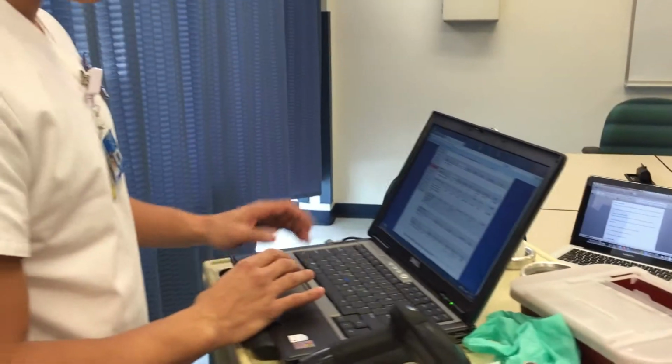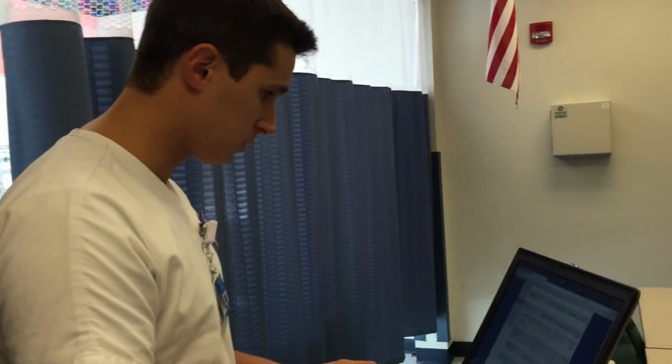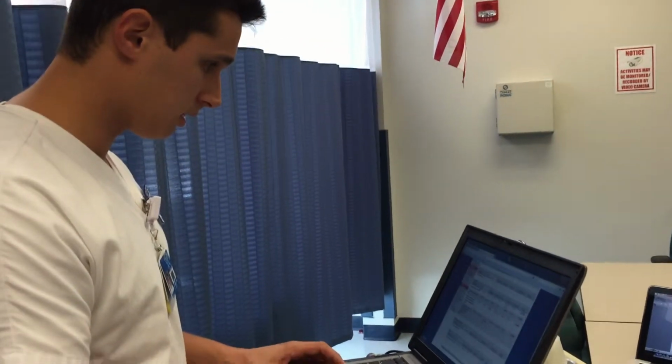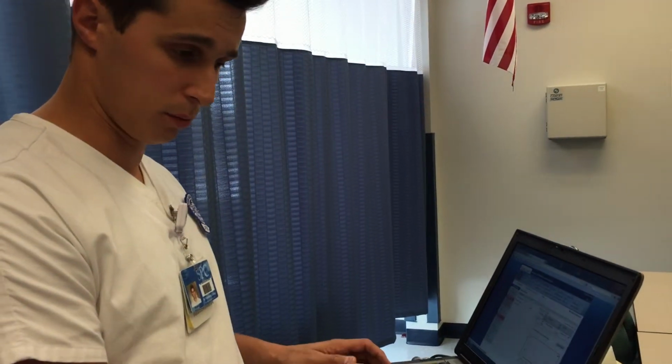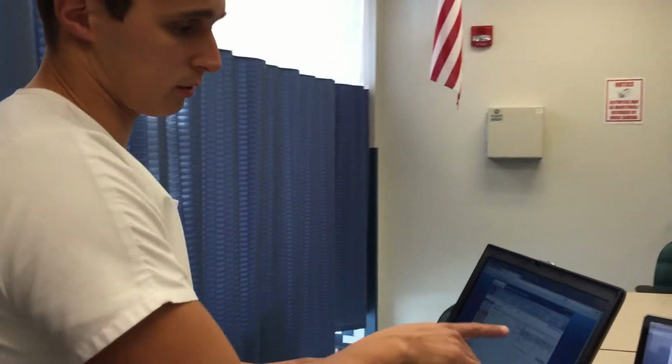We're going to draw the right dose. So what I'm going to do, I'm going to go into his vital signs and get the glucose level that he had. He had a 290. So we're going to go to the MAR and we're going to find out how many units of insulin we're supposed to give if he has a glucose of 290, and it was 15 minutes ago.